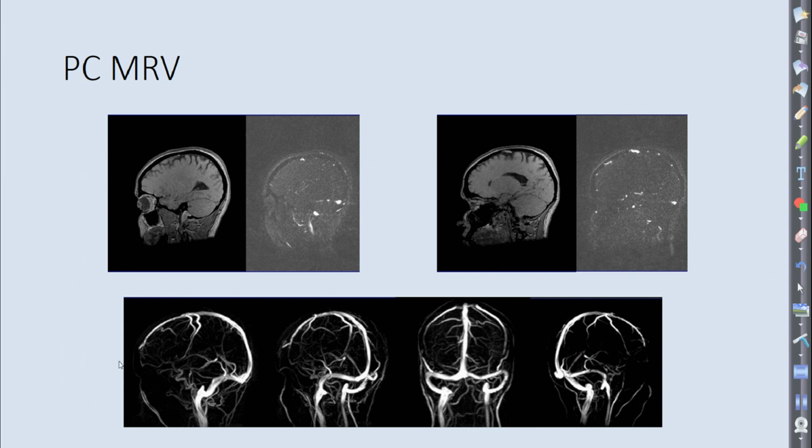This is what it looks like. Here's our source images, and then once again it creates one collapsed image here. And you can see that superior sagittal sinus very well.